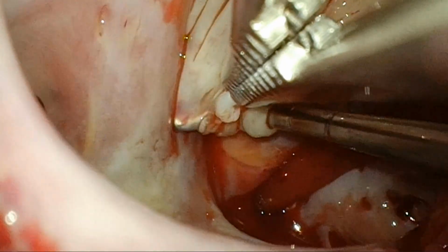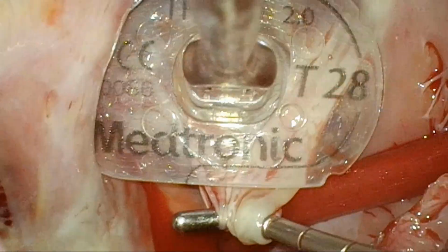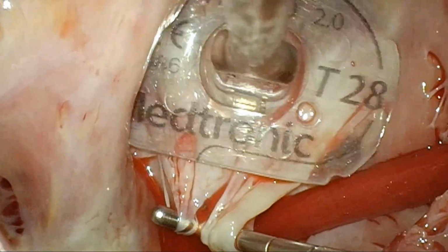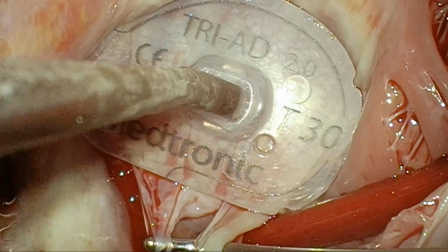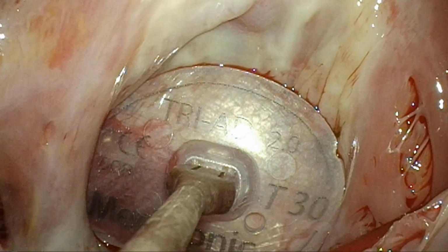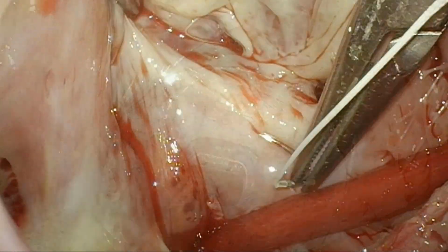So we size the ring based on the anterior as well as the posterior leaflet, and then we measure the surface area. We don't undersize these valves. You need to just true size these valves, because as I said, it's a prophylactic surgery. So this was a size 30. We do all these cases universally on arrested heart. We don't do beating heart surgery when you do concomitant, because you need to see everything and you want to avoid tears and dehiscence and injury to the conduction system, etc.